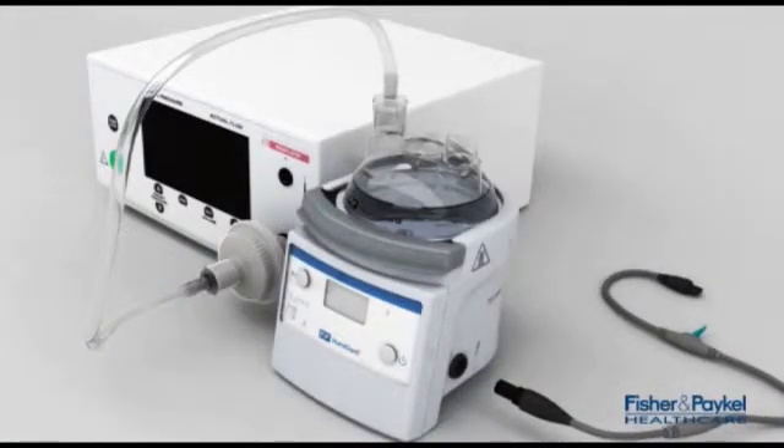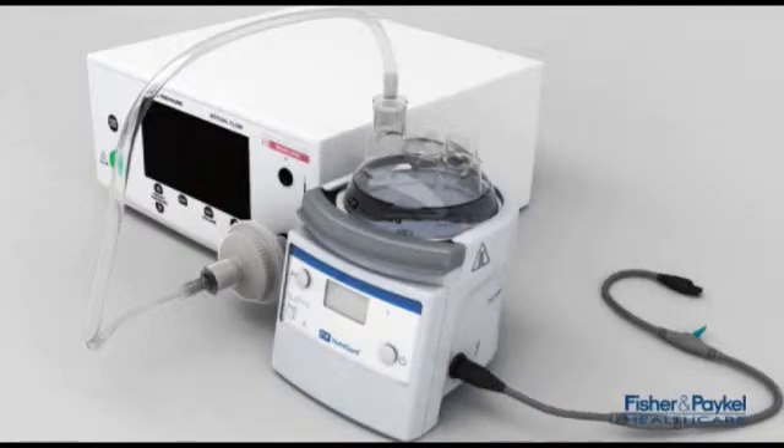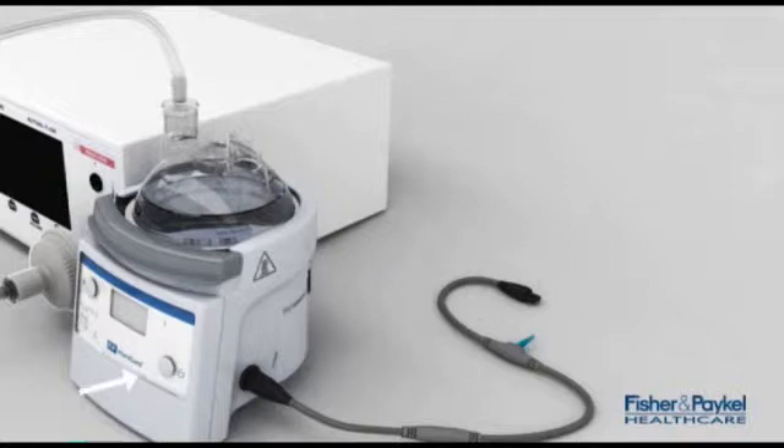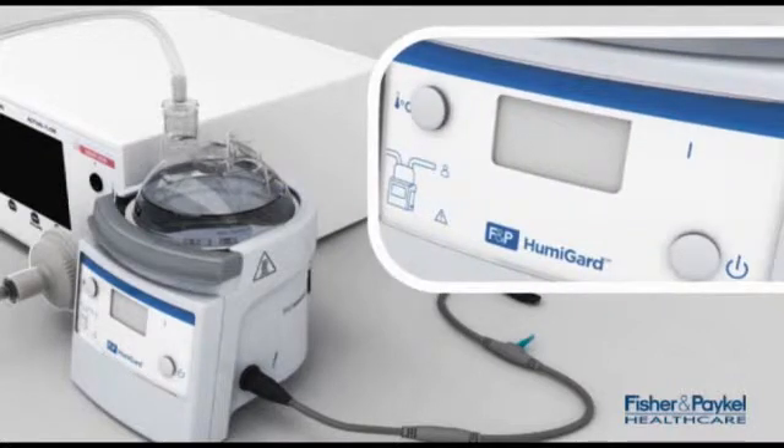Now the electrical adapter can be plugged into the side of the humidifier. Once this is done, the humidifier can be turned into preheat mode by turning it on. You can tell the system is in preheat by the flashing green light above the on/off button.